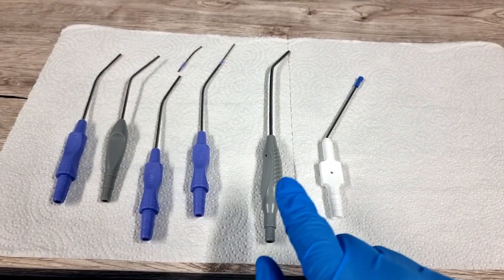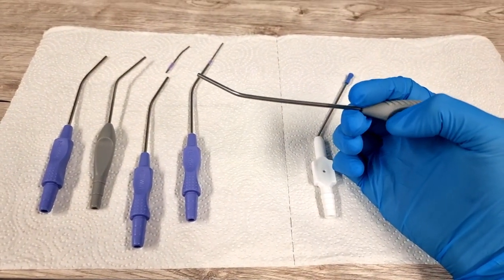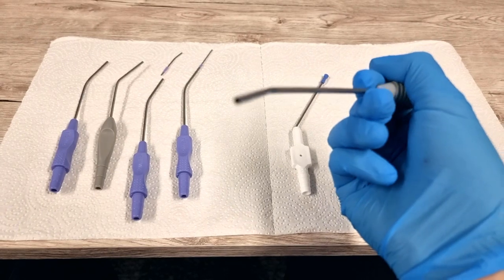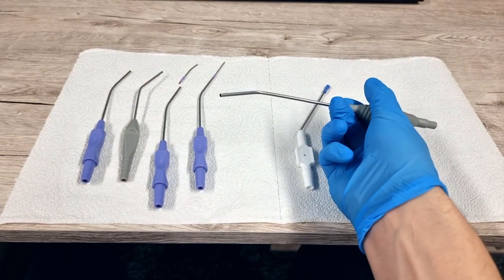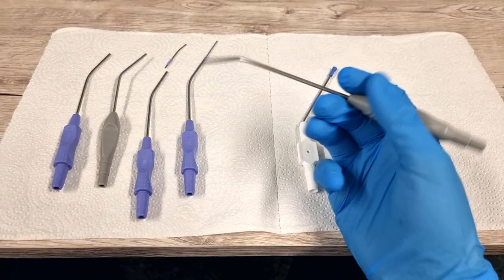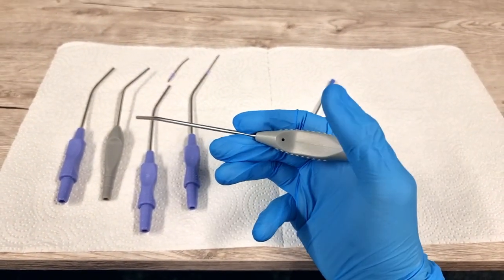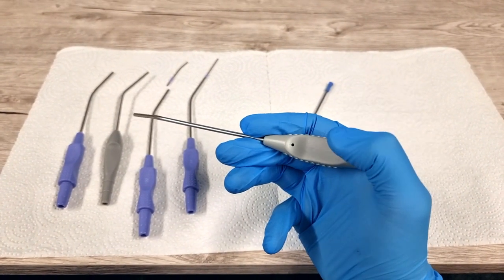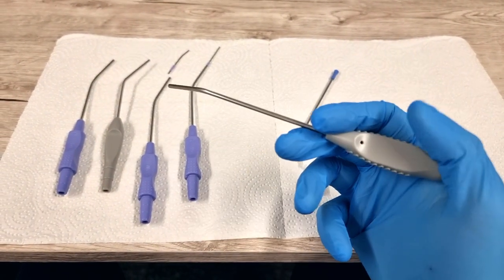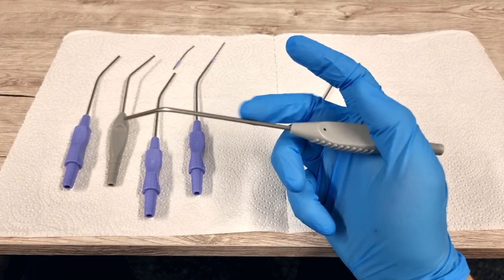Then we have the larger cousin of the Zollner probe. This is called a McGill suction probe. Again, very beefy, with a larger diameter bore. It gives you a bit more power, I suppose. There's a greater surface area for the material to get sucked into. There's a control hole here as well. You can buy regular Zollners with the control hole, but the idea is that when the hole is open, most of the air will be sucked through the hole rather than the end of the McGill. So when you're creeping into the ear canal and you've got to where you want, you can close the hole and then you'll get suction through the tube and material will be pulled through.